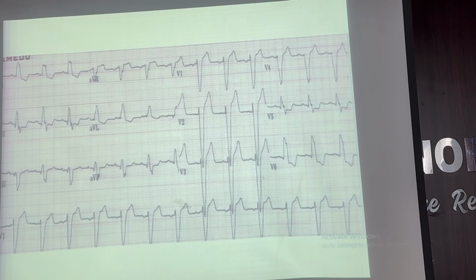Again, if a patient with classic chest pain comes with this left bundle branch block, and you don't have previous ECGs, then you are in hesitation, because if it is primary PCI, then it's straightforward. You can take the patient to the lab, and if you don't see a lesion, that's fine. Okay, I made a wrong diagnosis, no consequence. But if you thrombolyze for a false positive and the patient gets a complication, then that's a concern, right? So that's why please preserve the old ECGs again.